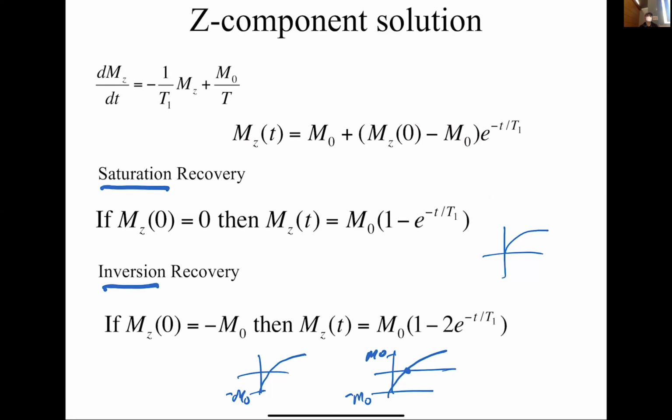But in general, if you're imaging someone, you might care how much fat they have in their liver, right? Fatty liver disease is a real issue. So a key measurement that's going on right now in lots of hospitals is people are measuring liver fat with MR, okay? And this isn't the only way, but this suggests that one way you can get rid of fat is by just nulling it out. Okay, so that's just to give you a preview of coming attractions.